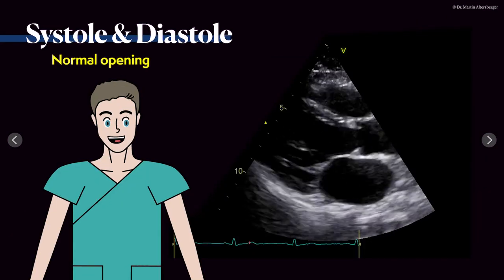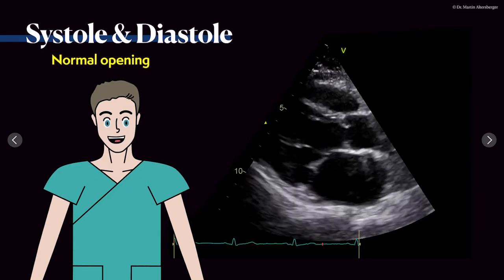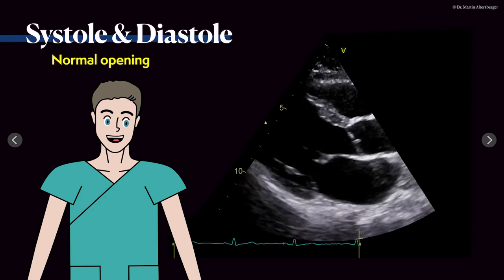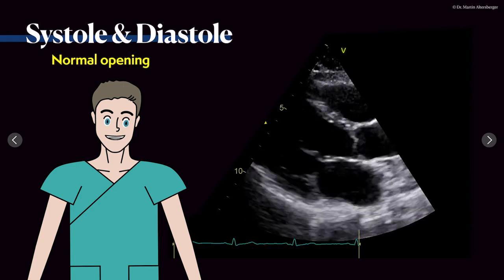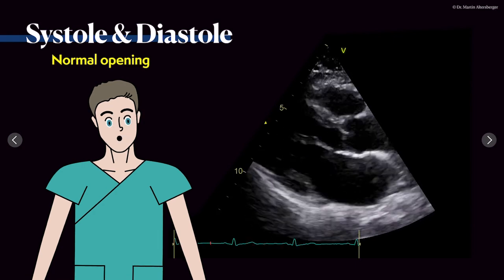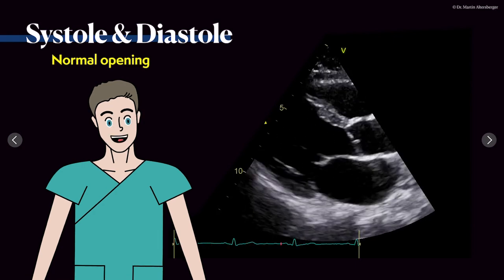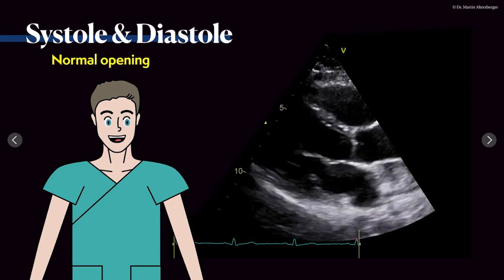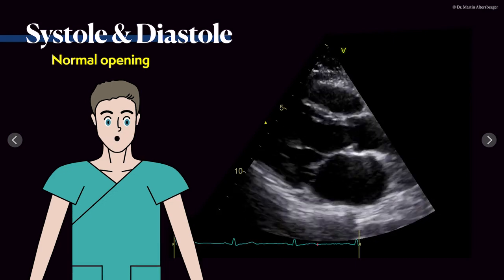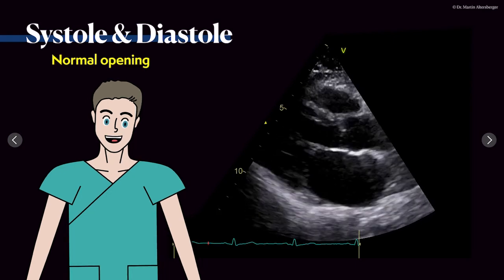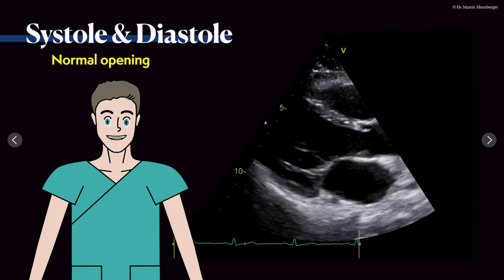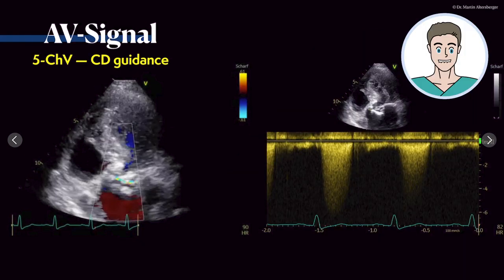Here is just another example where you see the opening and the closure in the parasternal long axis as it should be. This is distinctly different from what we have seen with our patient Ernest. The normal opening looks like this — opening in systole and closure in diastole.